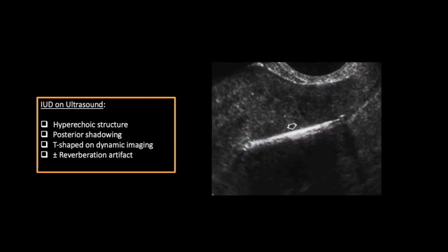So now we can zoom in on the actual IUD itself, which is clearly seen inside this patient's uterus. A couple important artifacts that help confirm the identification of an IUD are posterior shadowing, which is generally present, and reverberation artifact, which may or may not be present depending on the angle of insonation and the type of IUD placed. The landmarks to determine proper placement are the myometrium, the cervix, and the endocervical and endometrial stripe when they're not obscured by the IUD itself.